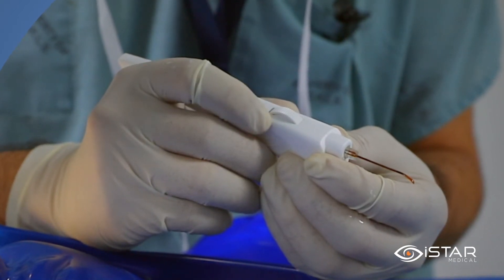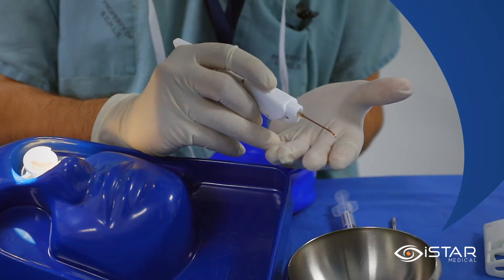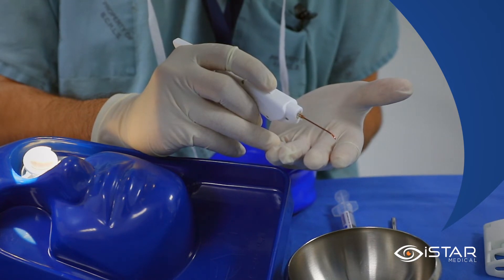Do not rotate the wheel posteriorly or the implant will be prematurely delivered. Once I have the delivery sheath in proper position in the supraciliary space, the actuation wheel will roll back, pulling the delivery sheath posteriorly, allowing the implant to then reside in the supraciliary space.